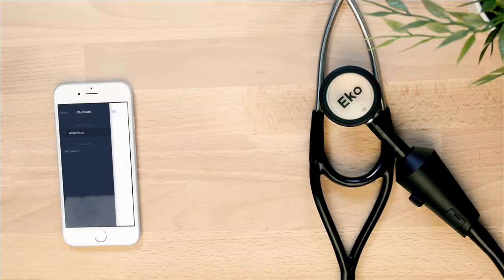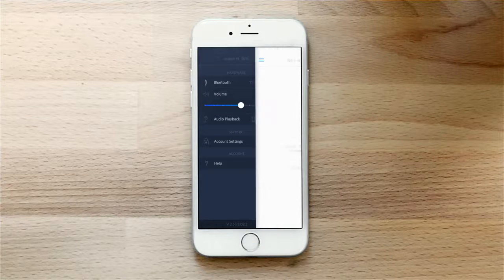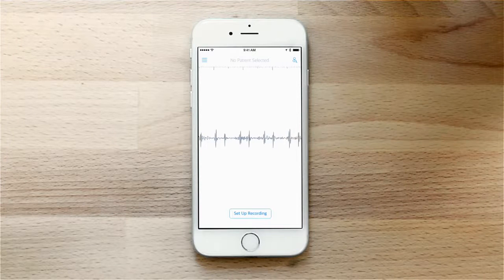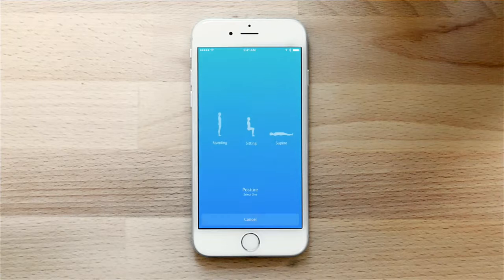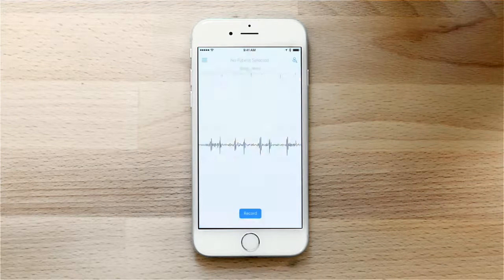Afterwards, you will see a live streamed phonocardiogram of the patient's heart sound. Let's set a 15-second heart sound recording by selecting the patient's position and auscultation location. In this example, we'll do a mitral recording.